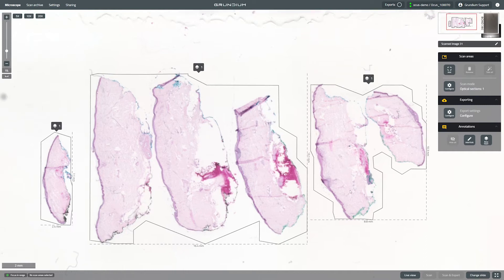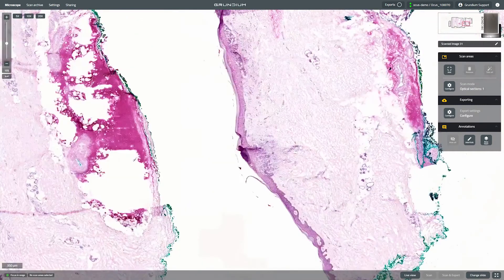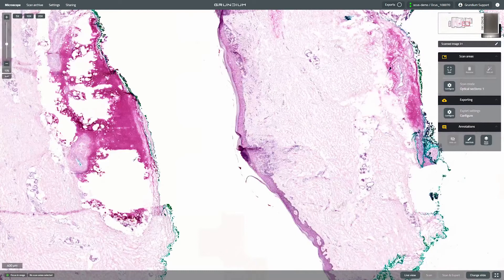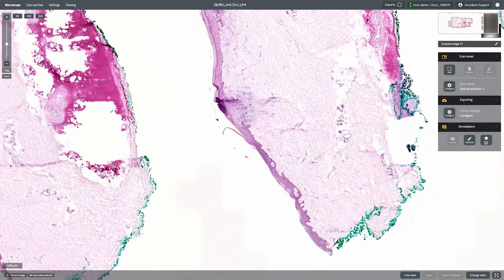Here's how to use the Annotation tool on your Grundium Ocus scanner. With this tool, you can easily mark areas of interest and leave comments for collaborating experts.